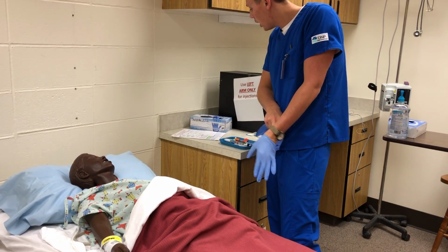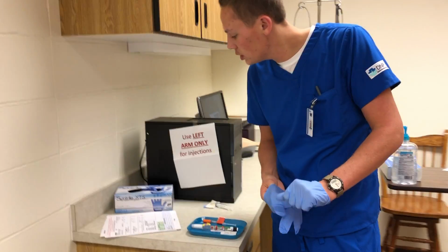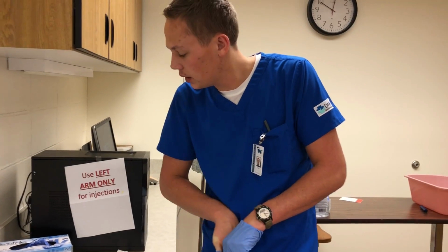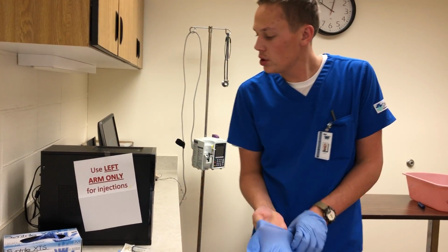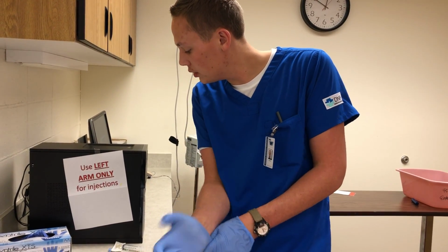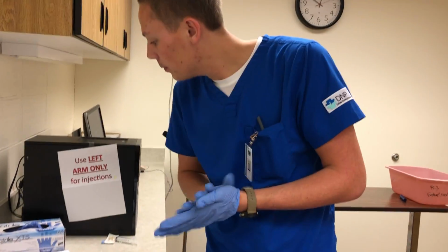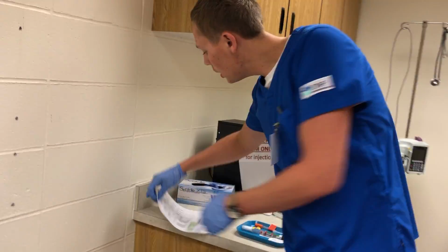So yeah, I got your NPH insulin and your regular insulin. And do you usually mix those at home? You do? Okay. So I got that all in one syringe for you too. So I just want to make sure.